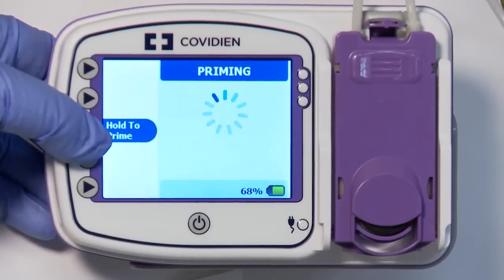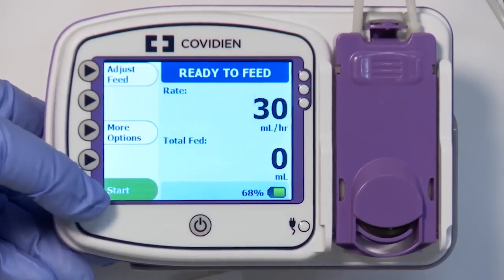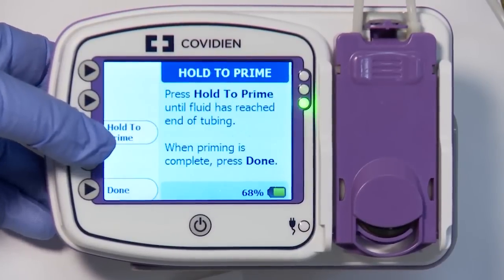To continue with pump setup, press Done. If desired, Hold to Prime can be used instead for a manual prime. Press and hold the Hold to Prime button to begin the manual prime. Press Done when complete.